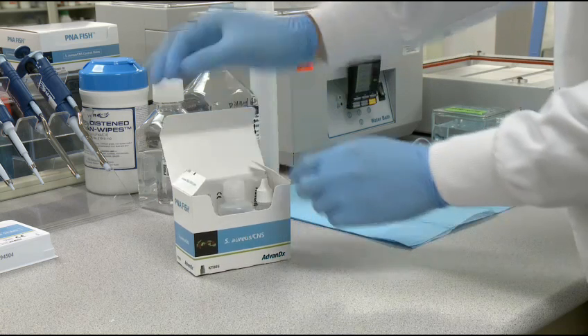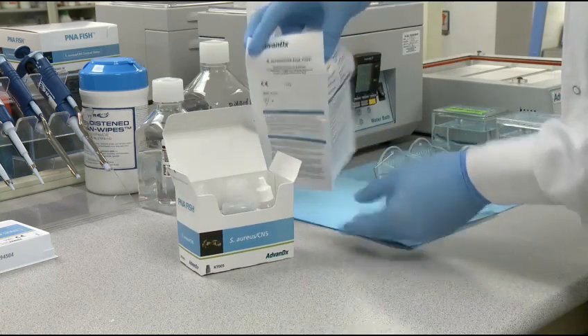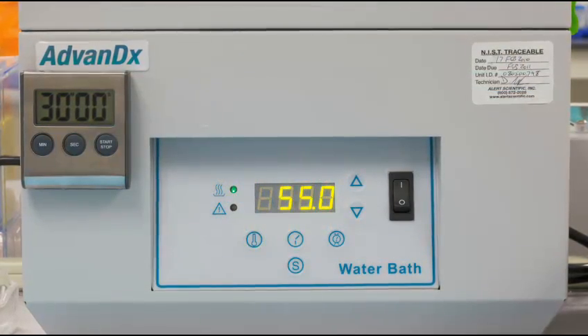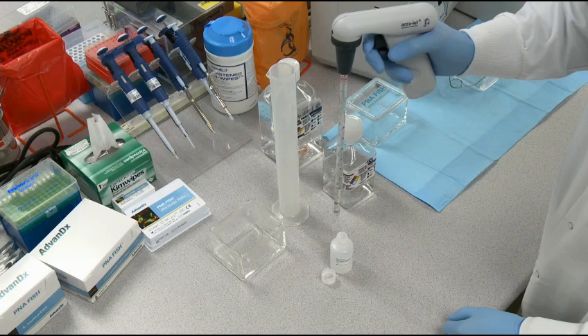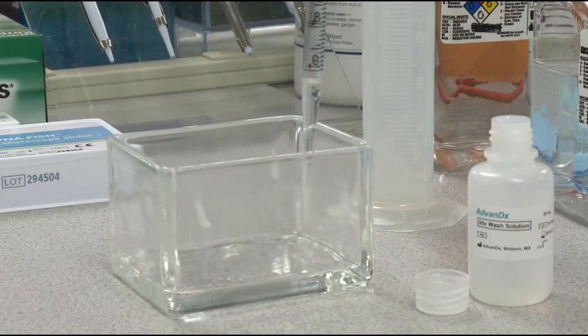Before you begin, be sure to review the package insert for complete instructions. Make sure the P&A FISH workstation and water bath are switched on and set to 55 degrees Celsius. Next, prepare the wash solution: add 4ml of 60x wash solution to a staining dish.